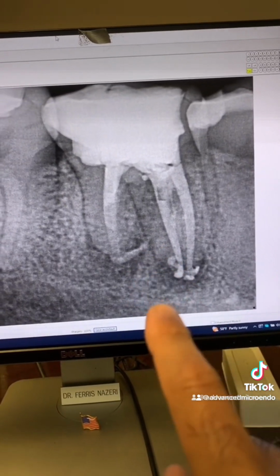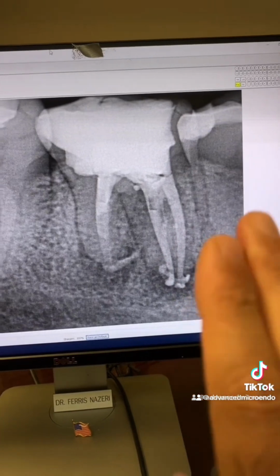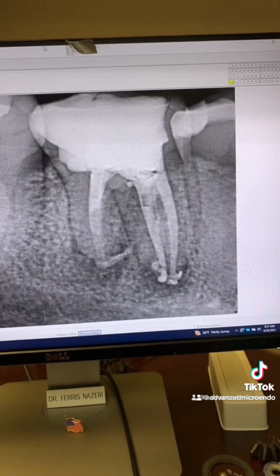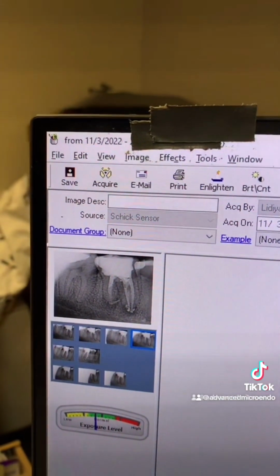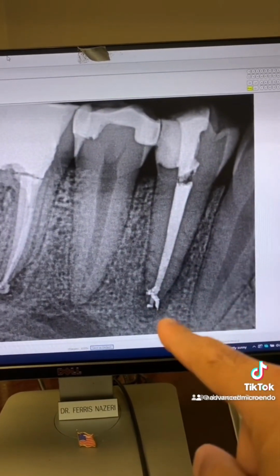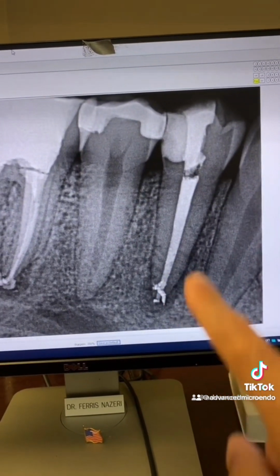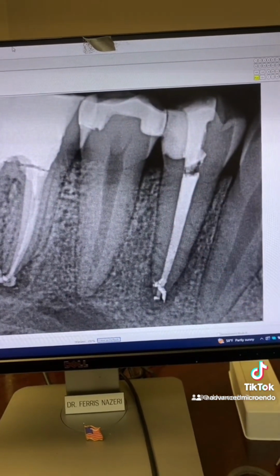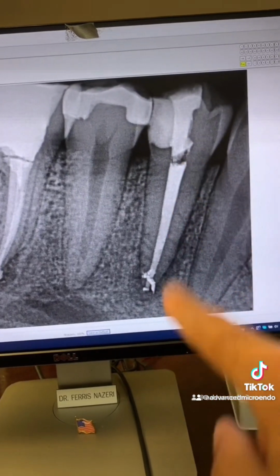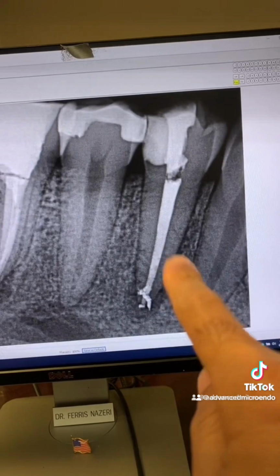Okay, so we did all of this in one appointment. This is one appointment endodontic retreatment. And here's the date. Then the patient came back and I worked on tooth number 28 and did that root canal again in one appointment, removed the decay, rebuilt the distal wall there, and as you can see, everything went great again. As I said, we did this in one appointment.